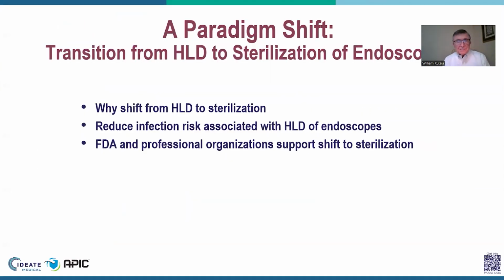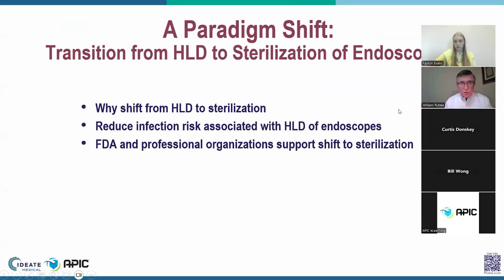In the next slide, essentially, we see what we intended to do. We intended to talk about this shift and why this shift is important. And of course, this shift is important for many reasons, but most important, to reduce infection risk associated with high-level disinfection of endoscopes, and the fact that the FDA and professional organizations have supported this shift to sterilization.